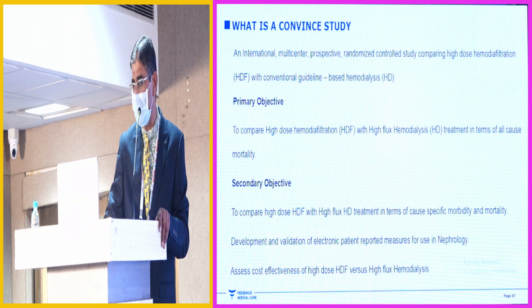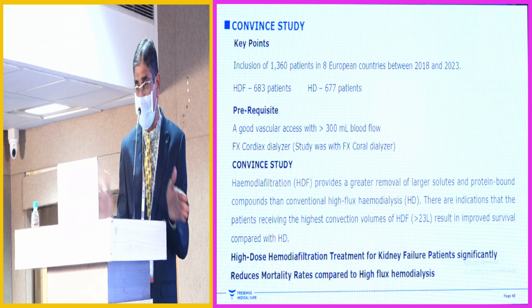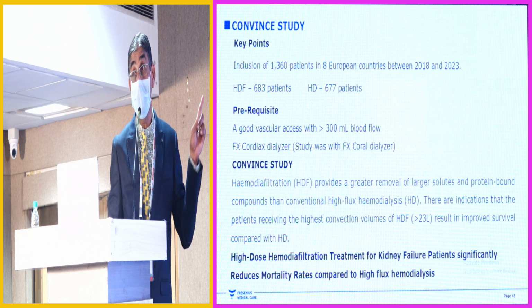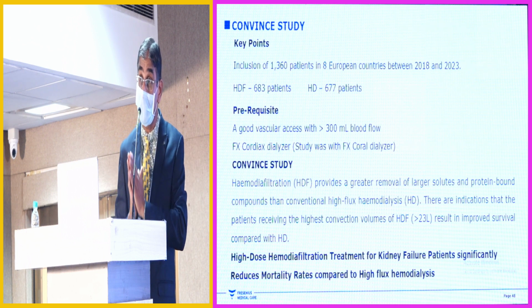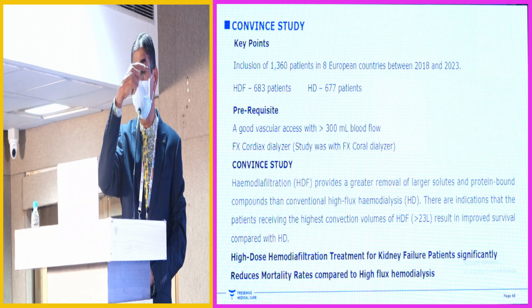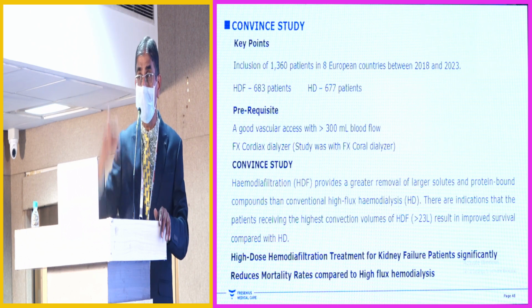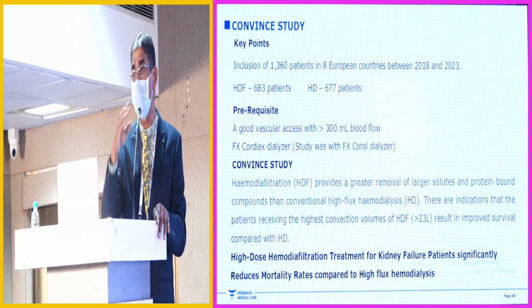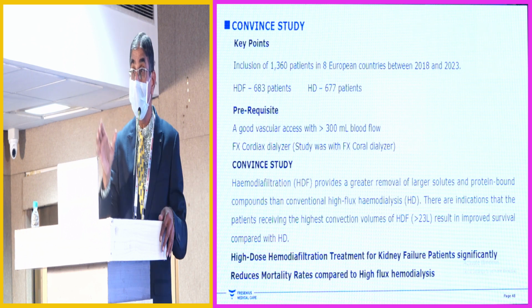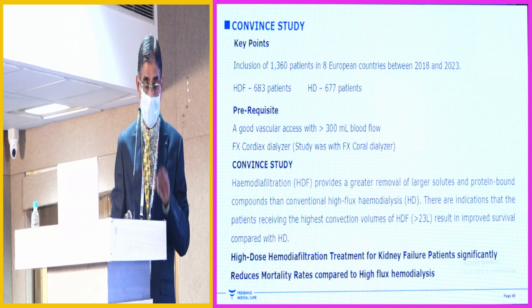So now the Convince study has come. This is almost my last slide. 1,360 patients they have compared, and they have not used the dialyzer that is existing in India. I have to honestly tell. They have used an FX Coral dialyzer, which has a hydrogel inside. That is definitely enhancing the clearance, because one of the speakers did mention the polarization probably after 2 hours or whatever, and that is definitely hindering the normal middle molecules or better higher molecule clearance. So what I'm trying to say is, even if you don't have that, we have a dialyzer which has a higher diameter, and the wall thickness is also increased.